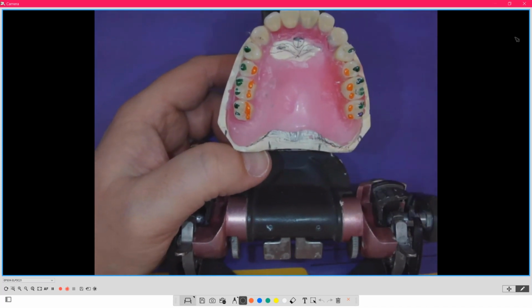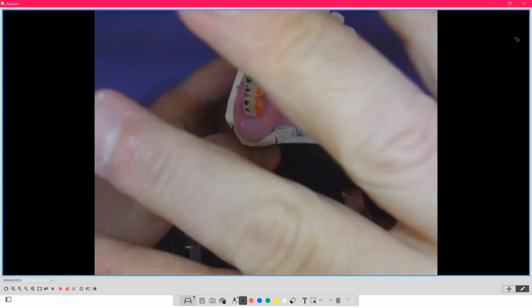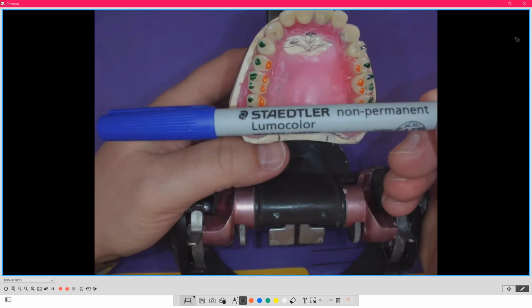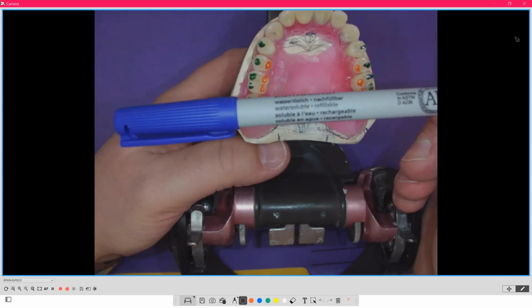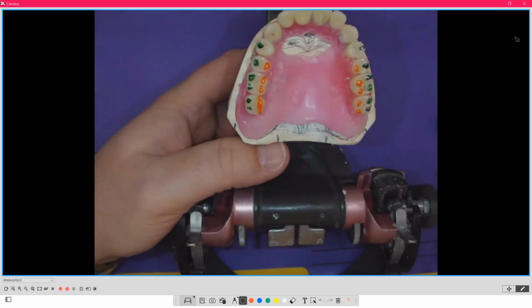I don't use articulating paper. Articulating paper bends, even the silk stuff. It bends and you can get wrong readings. I use Staedtler Lumicolor non-permanent marking pens. Made in Germany. And what that does is it's more accurate. It's more finite, so you have to watch for it.